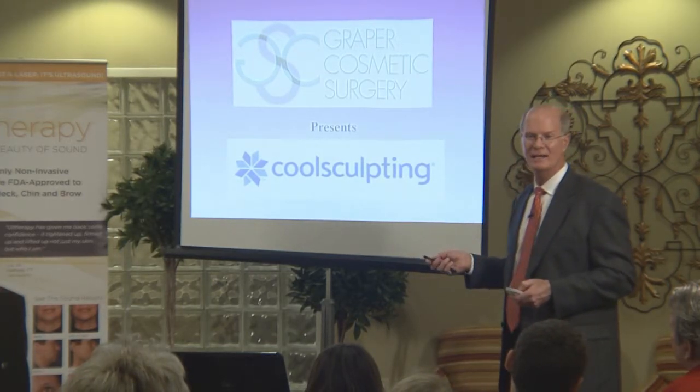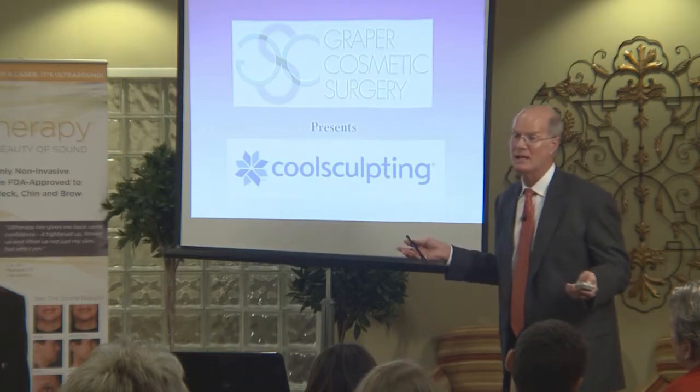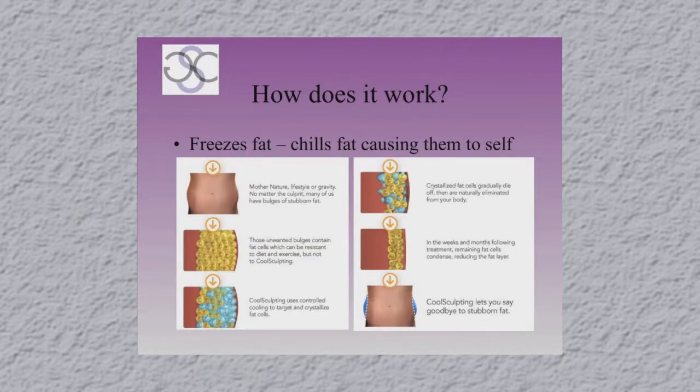CoolSculpting has none of that, but you're only going to get 22%. Whereas with liposuction, you're going to get 80, 90% of the fat you want to get off. No incisions, no anesthesia, no recovery time, but 22%. And if you do it twice, and you can do it a week later, a second time, mathematically, you can get 40%.